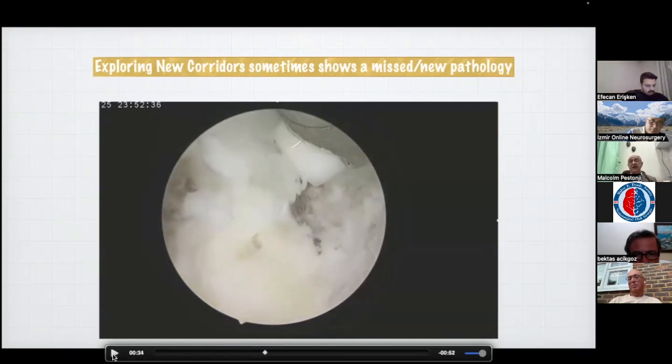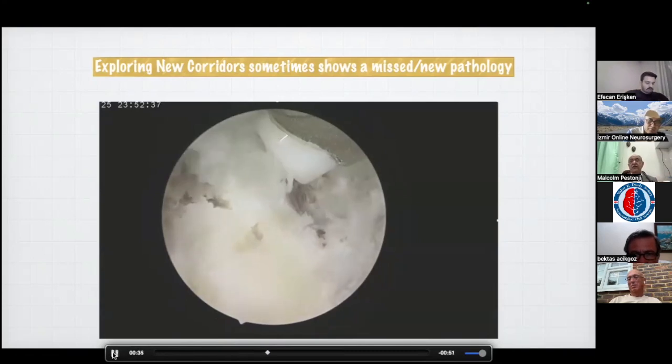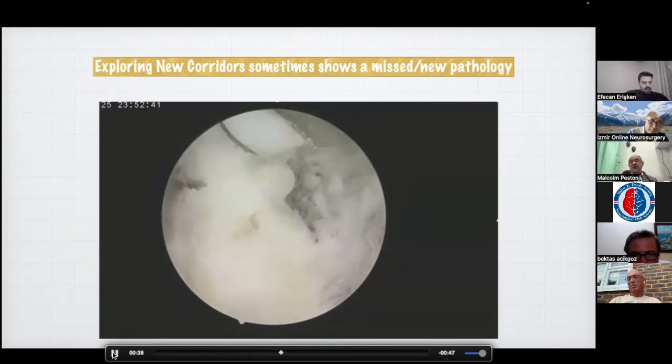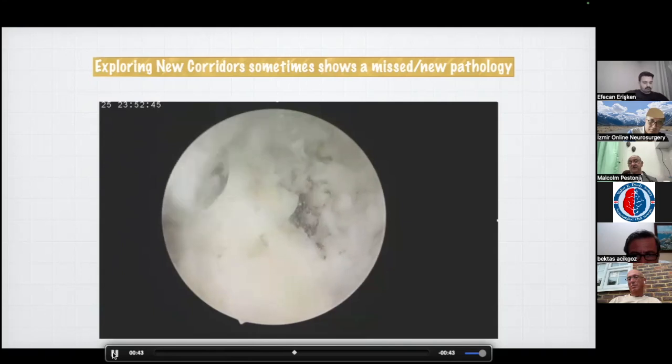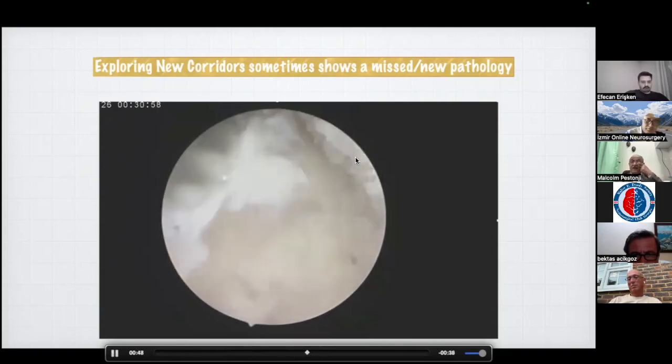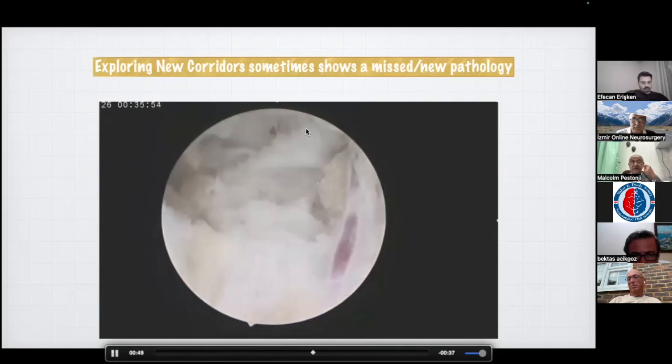And when I do the para-UBE, you can see this white calcified huge ligament sitting in the foramen. This is the corporotransverse ligament, the superior corporotransverse ligament, which is coming from the transverse process above to the ala below. As I burr away the ala, this ligament tears away, goes away.